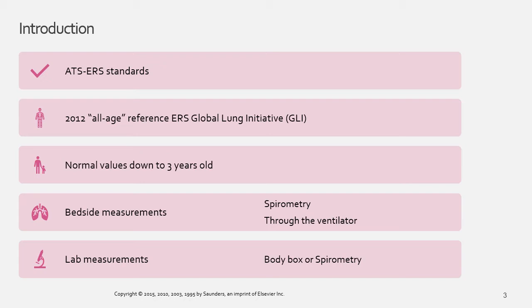PFT measurements include bedside measurements with a bedside spirometer or through the ventilator, and lab measurements using a body box or full spirometry system.